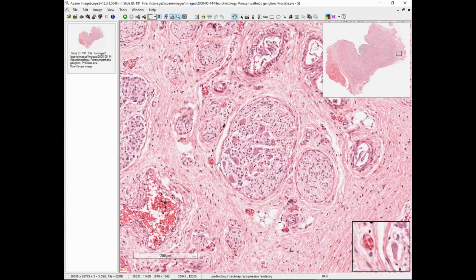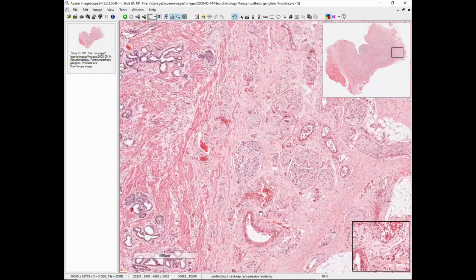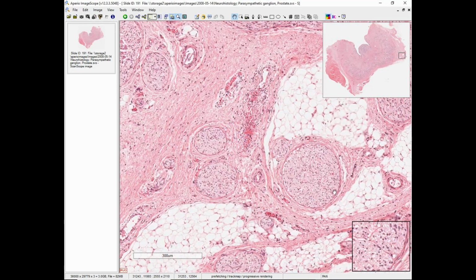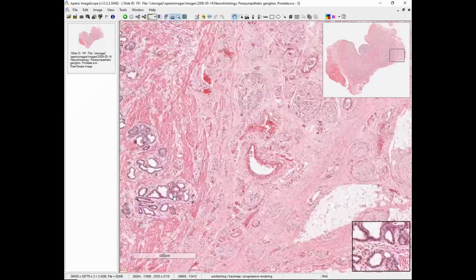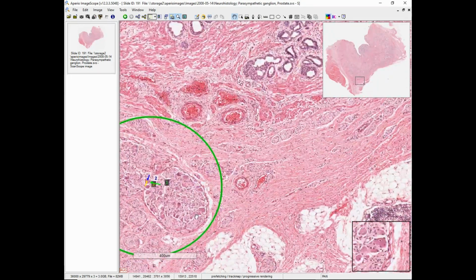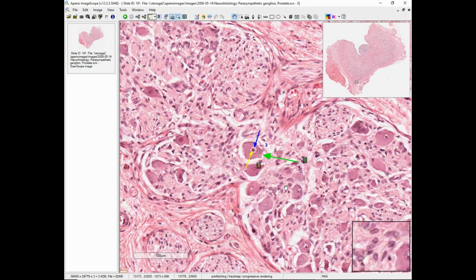The other thing is that they're in the wall of an organ, not in a posterior root ganglia. So you'll get better at picking up those cues as you go. We've actually got some nerve fascicles here leading to and from those, but we're not going to sweat that right now. So let's scooch back over here to this area where we can quiz ourselves. And I can zoom in here. Just tell me what you're seeing in arrows 1, 2, and 3.